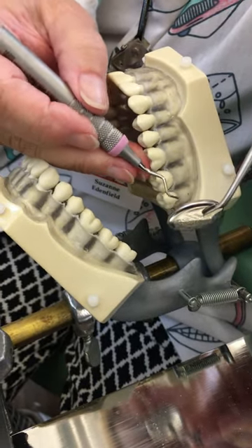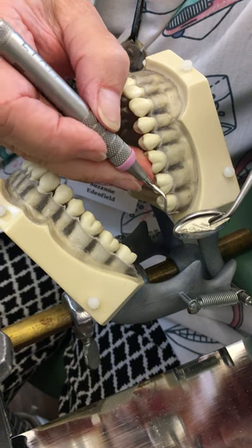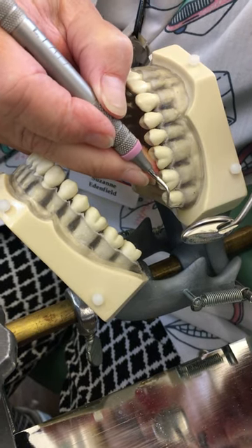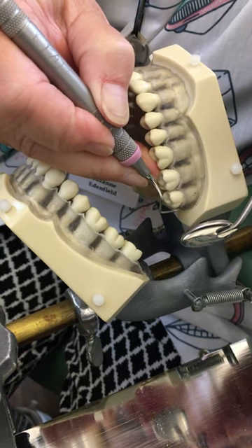I'm just going to move over, same end — it's a mirror image. I'm going to come up on my fulcrum, toe angled apically, pulling closed or close to the tooth, and then open, go around the distal line angle, and onto the distal surface.